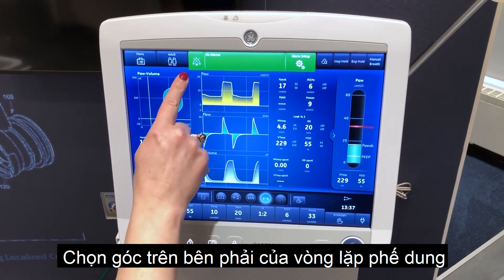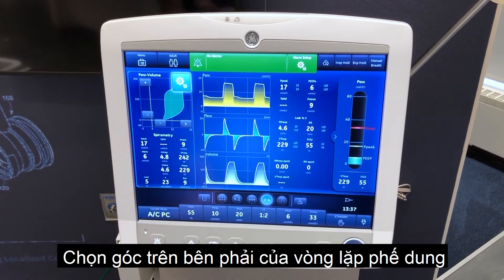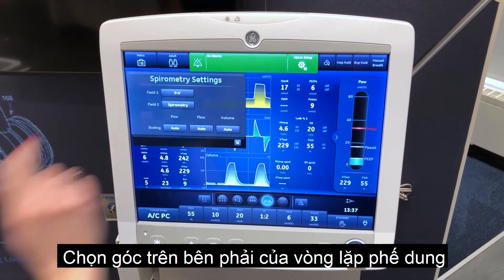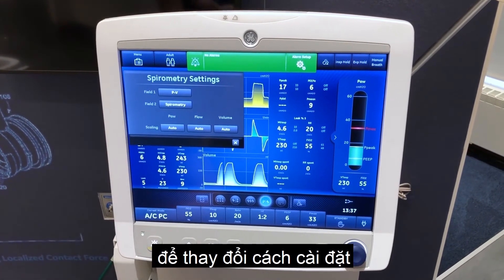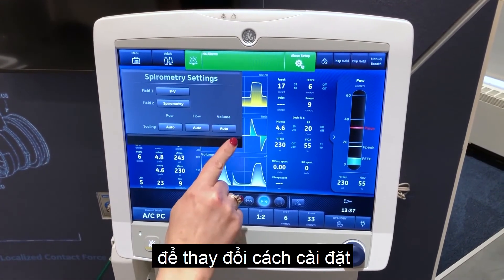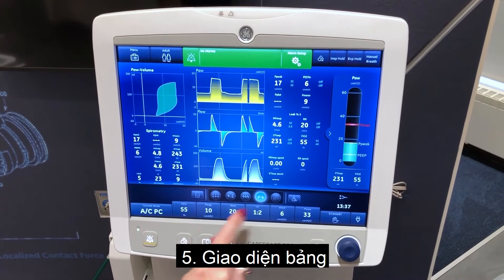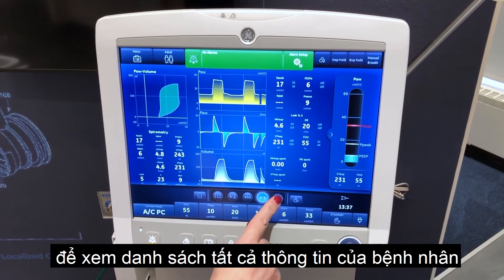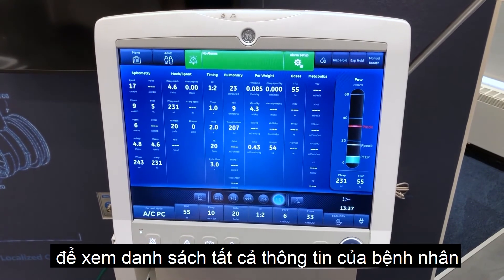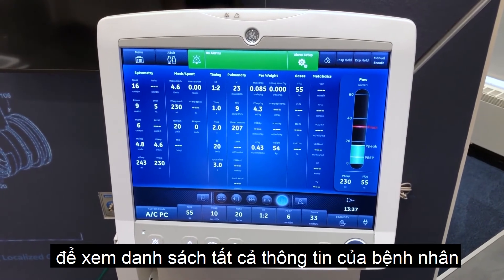Select the upper right corner of the spirometry waveform to change settings. Charting view to see a complete list of patient data.